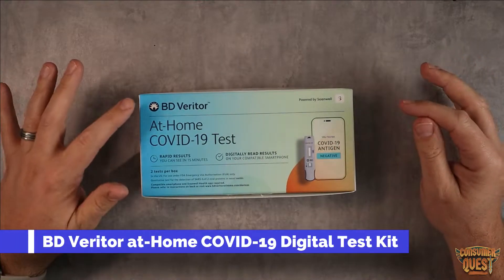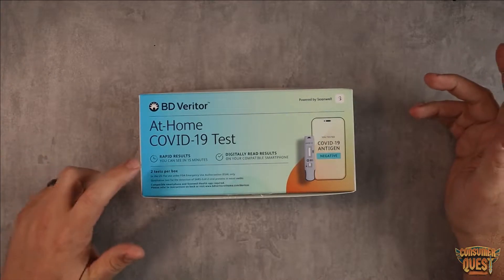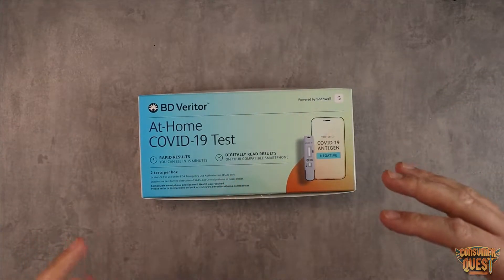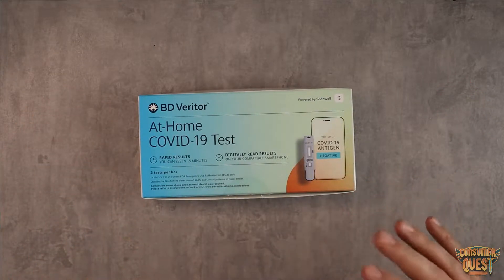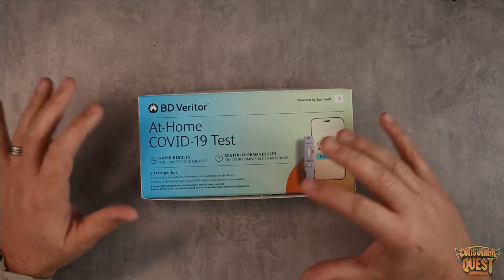What is going on guys? Today I'm going to show you the BD Veritor at-home COVID-19 test. This is rapid results in 15 minutes, and you can digitally read the results. You can actually use the app to interpret the test as opposed to a person reading a little bar. That's kind of a neat feature — that's why I ordered this one. I wanted to check it out and see how that all worked.